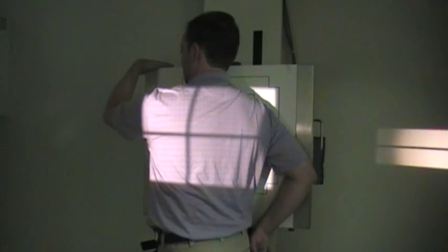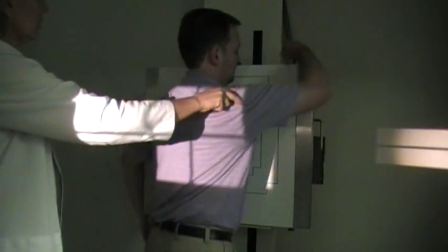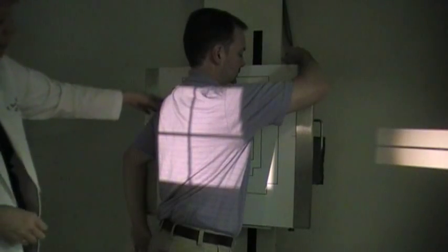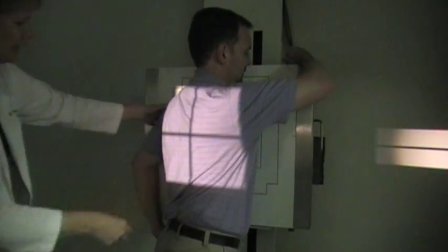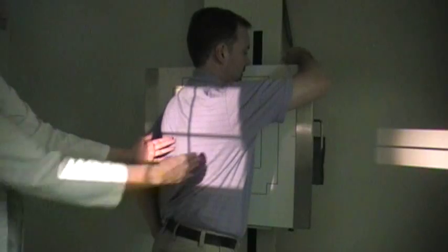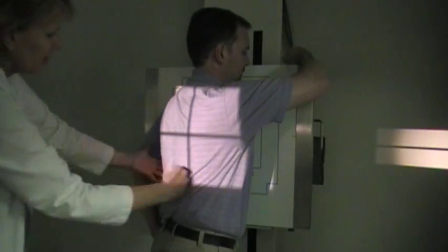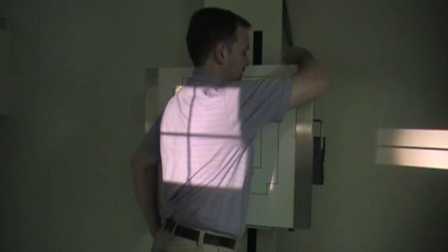Okay, if we want to demonstrate the right lung the best, then we would do an LAO. David's 45 degrees. Okay, and you want to check halfway in between here, but make sure your light field cuts across both edges. It's important to compare both sides. Okay, so this is our PA oblique for the chest.